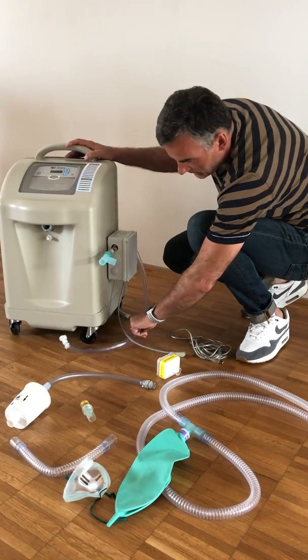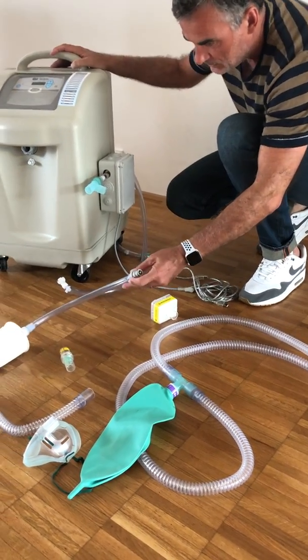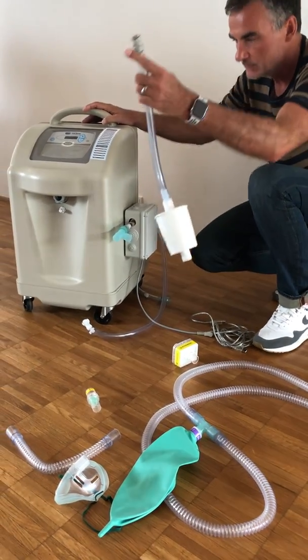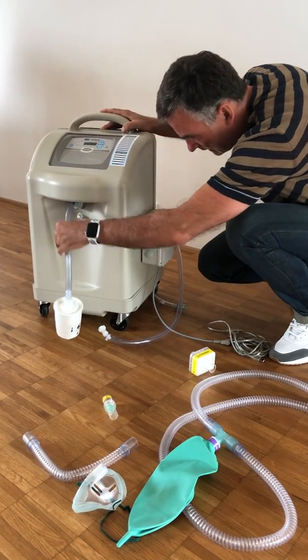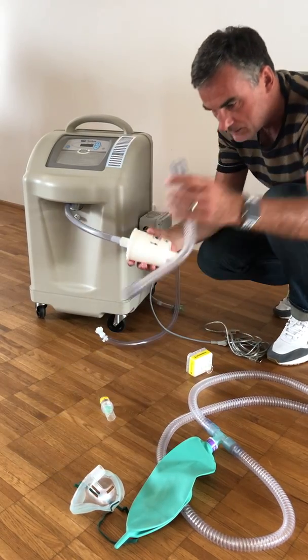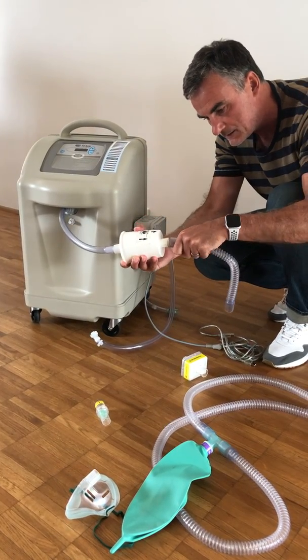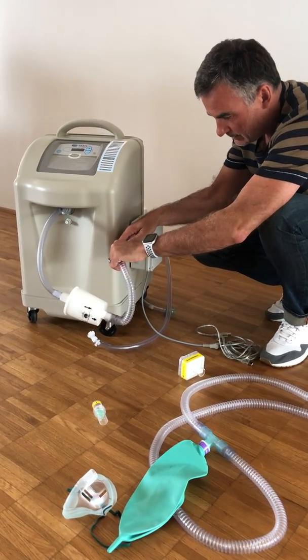First of all, we have different connections and different settings than we have with the EHT. First, you connect this to the generator in the big hole. Then you take the small tube and connect it to the HEPA filter, and then you connect this here.